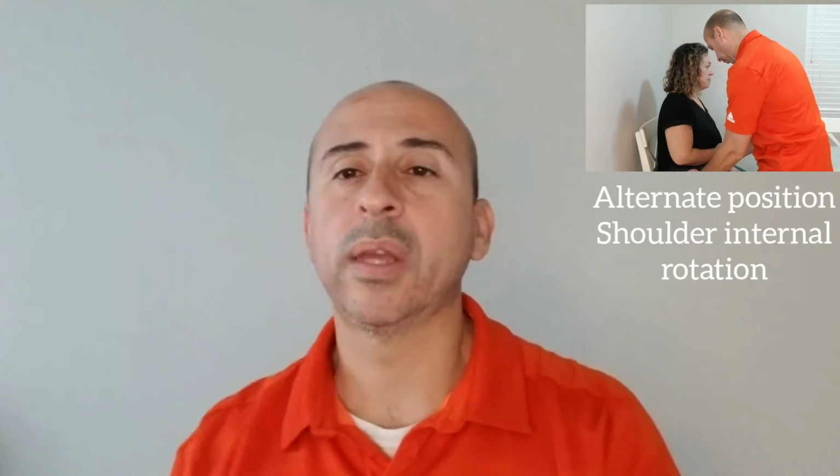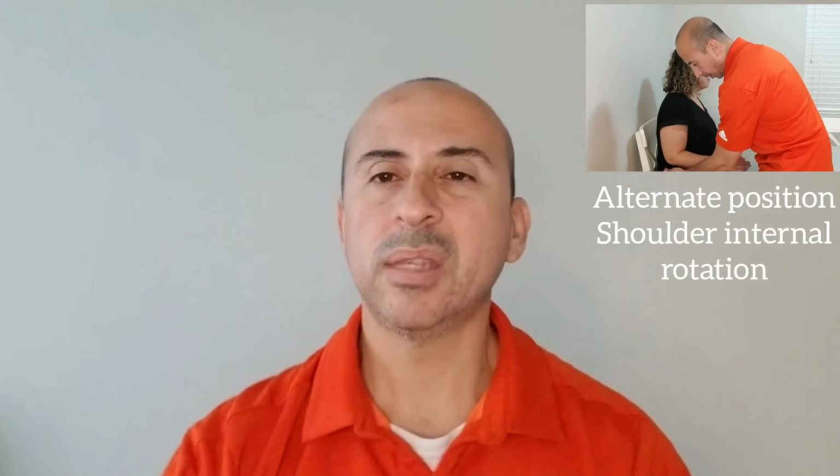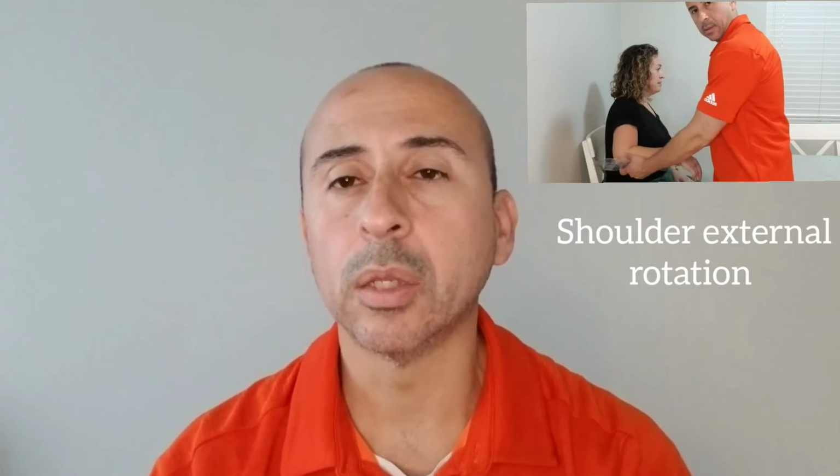If I'm trying to do shoulder flexion and the person's hiking their shoulder up, or I can automatically see they're compensating, I'll try to put them in a position where they're less able to cheat or compensate, or that's going to be more comfortable for them. So as I do the goniometry and I start stretching to see their maximum range, it'll be the most comfortable position for them, and also allow me the ability to manipulate or grab their body parts so that I can do that while maintaining the goniometer in the right place.